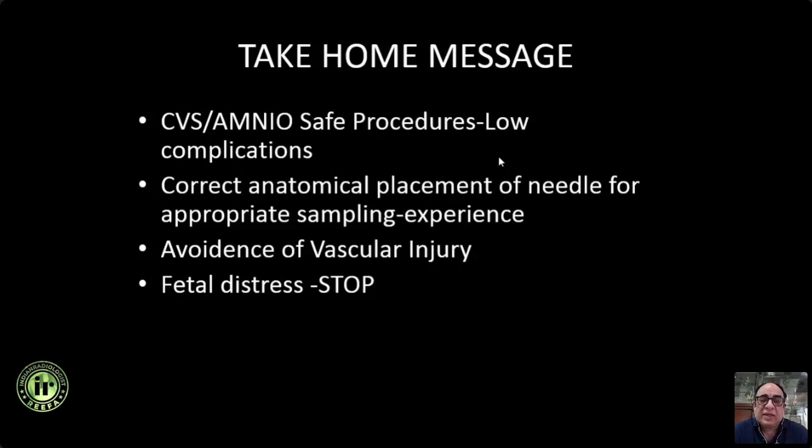What's most important is that there should be correct anatomical placement of the needle. And like I said earlier, you need to train yourself, go to a teaching hospital or with some dummy, you try and target, and most radiologists are fortunately very good at this. Very important to avoid vascular injury of any form. Do not target the uterine artery, the iliac arteries, etc. And the moment you have fetal distress, please stop and ask for help.